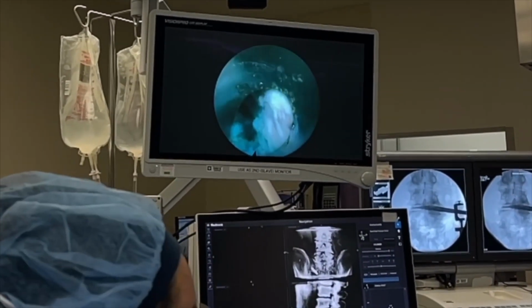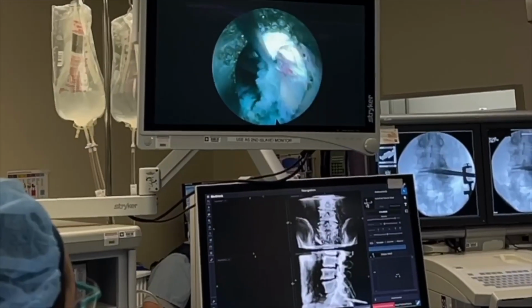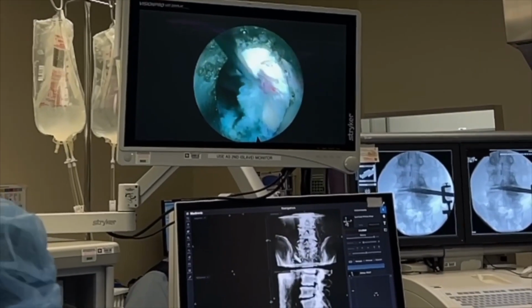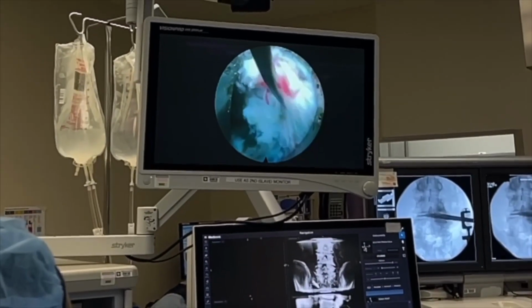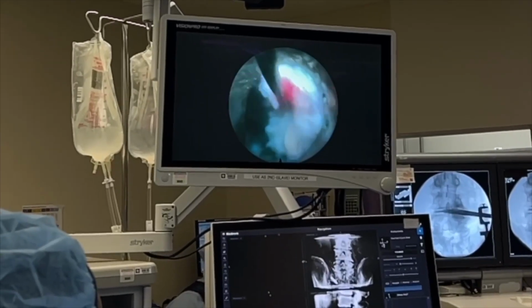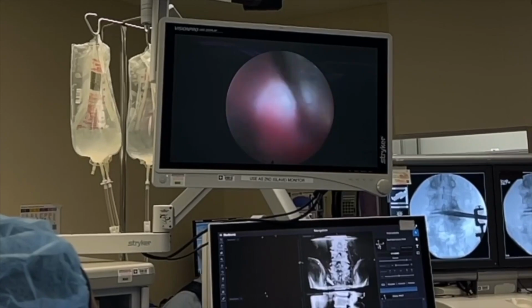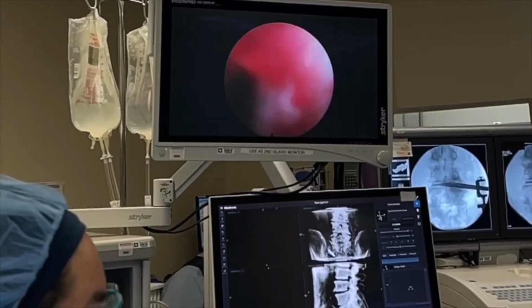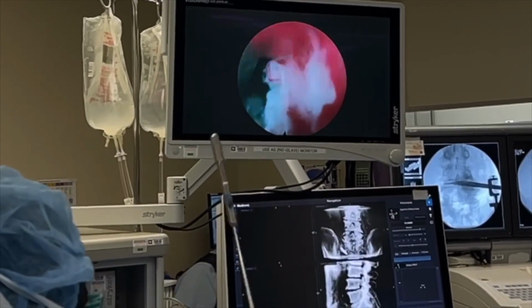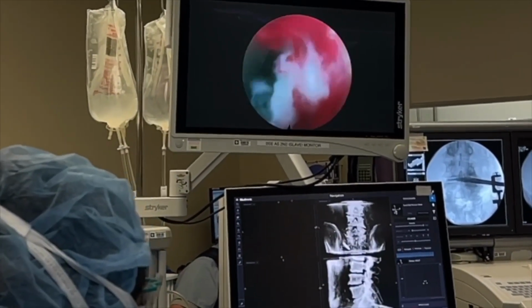There's the nerve. Ball tip feeler now. So I want to make sure that the exiting nerve root is free. Oh, yes. And it's surrounded by blood vessels, and that's why my mama said spine surgery would be so much easier without blood vessels and nerves. But that's a good sign, even though it's annoying.